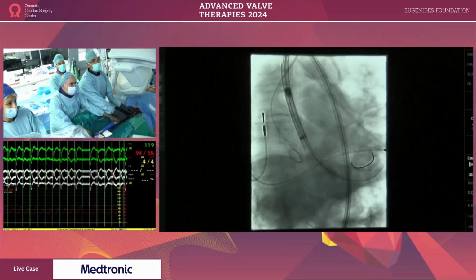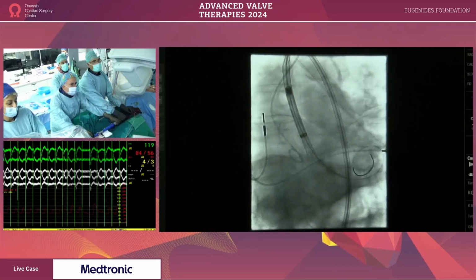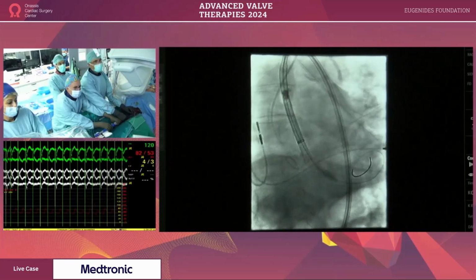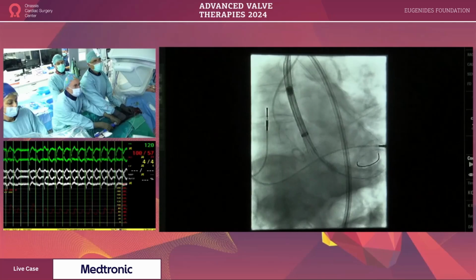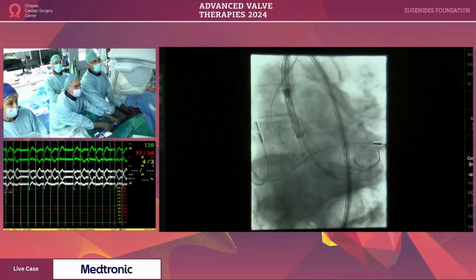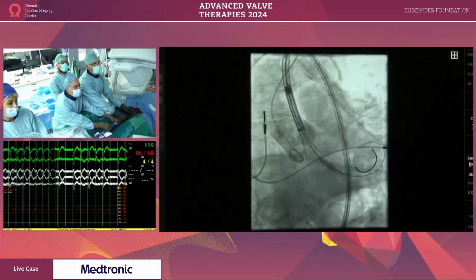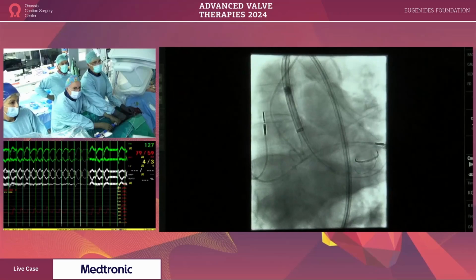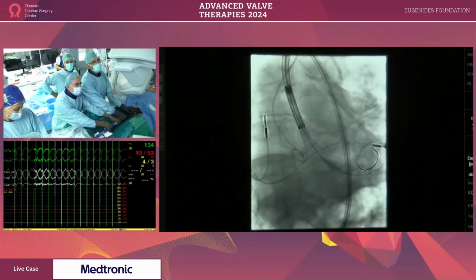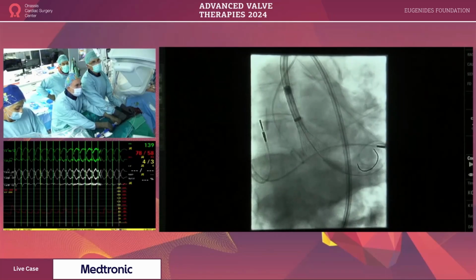It's a difficult implantation, you see. Yeah, so it's not a proper alignment. Yes, how unstable the valve is. Yeah, and it's challenging. Yeah, it's good. You can use some more injections in this situation. Spend a little dye to be sure, so you don't have to recapture. Looks good. Keep going. You can go fast pacing. To slow down this up and down movement, you got to go fast pacing before it pops up.